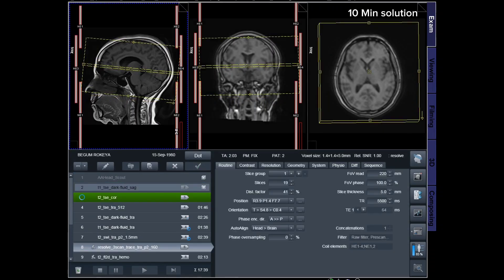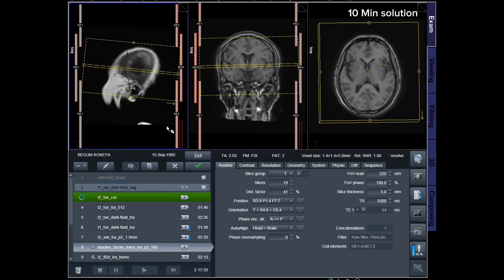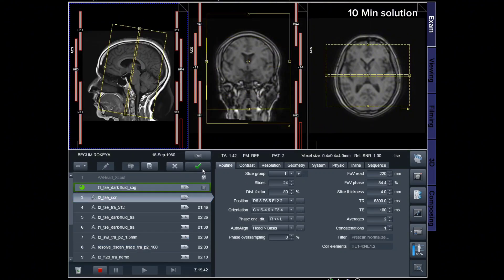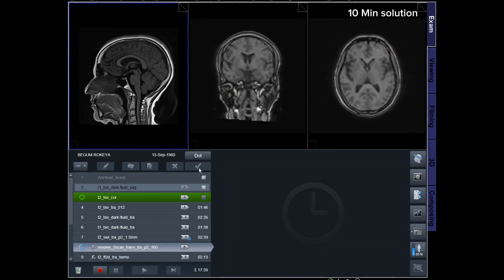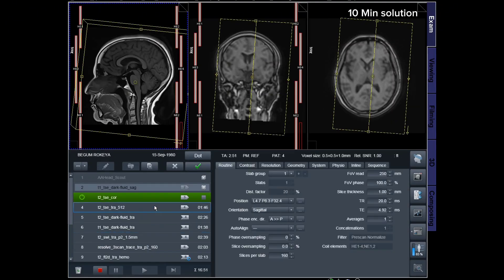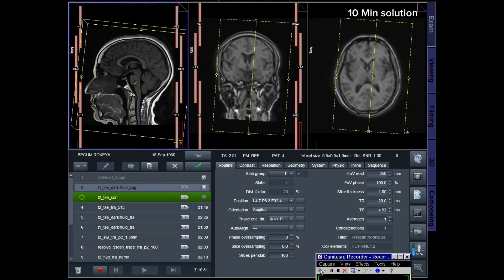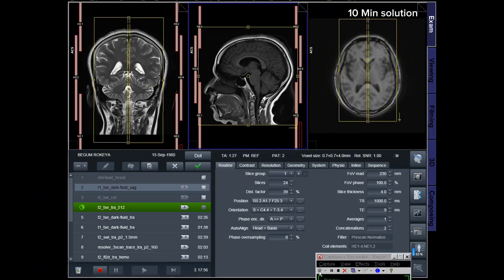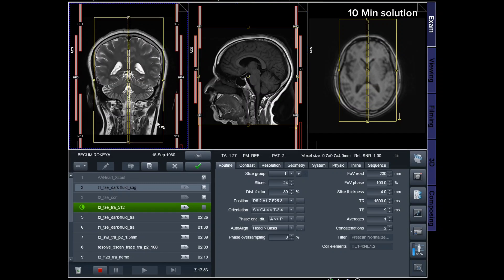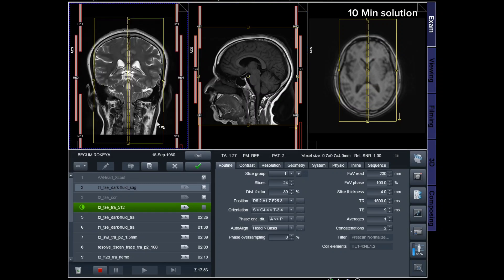For DWI axial, plan appropriately in the coronal plane, ensuring it is parallel to the line along the midline of the brain and the fourth ventricle. For T2-TSE sagittal, position the block parallel to the midline of the brain. Verify the planning block in the other two planes, ensuring coverage from one temporal lobe to the other.